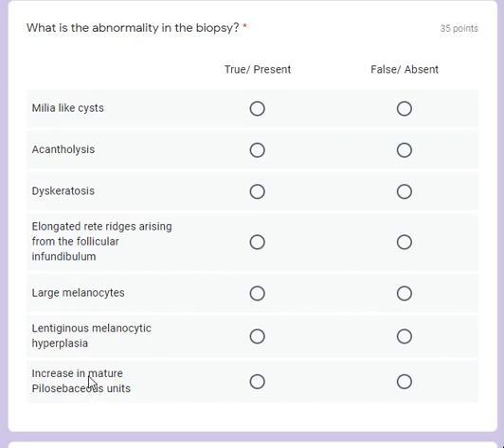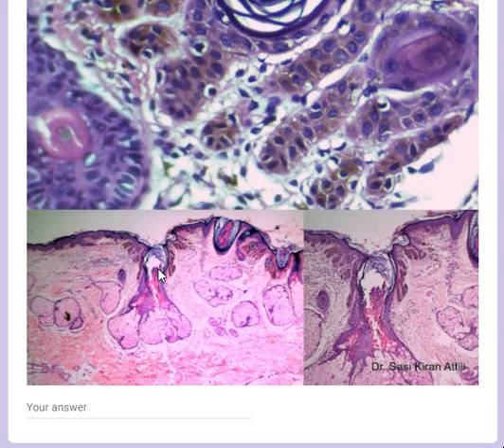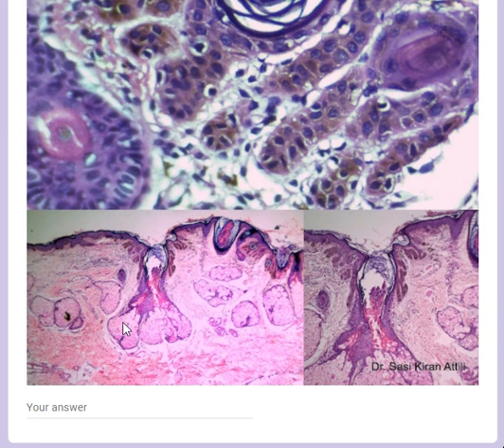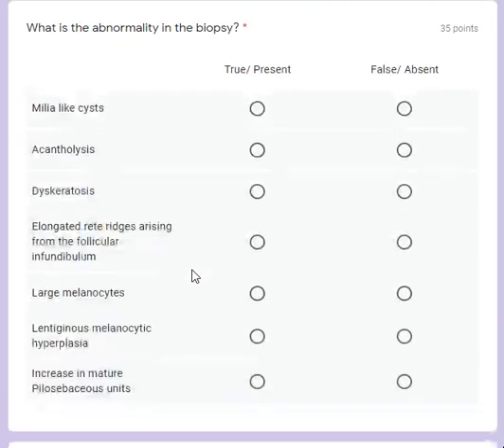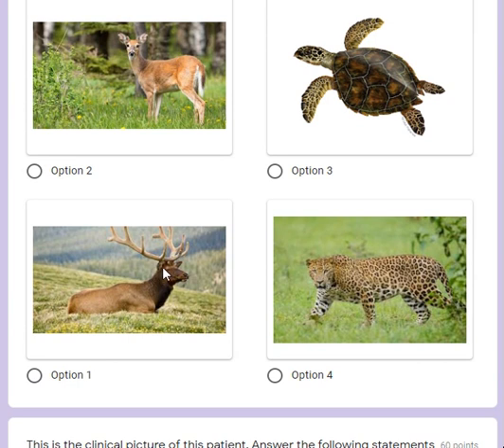Lentiginous melanocytic hyperplasia is usually seen in acne lentigenes, but that is absent here. Regarding the increase in mature pilosebaceous units - this is actually an immature pilosebaceous unit, because you can see these sebaceous glands not opening into the hair follicle, and when they do open, they're opening directly onto the surface. This is just an infundibular structure with no hair.